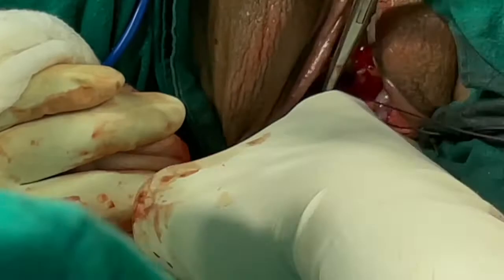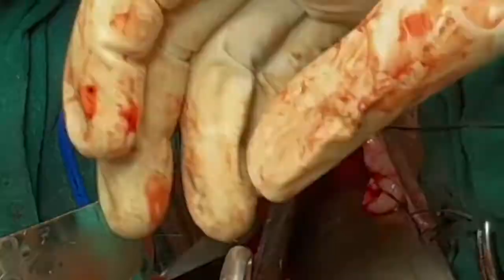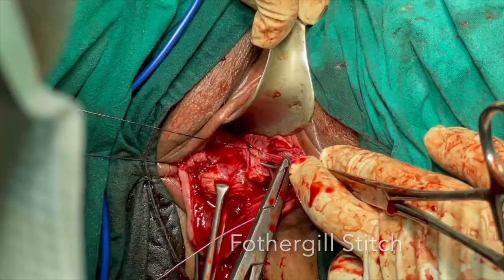In this case, we decided to do sacrospinous fixation of the posterior vagina. Using three Deavers retractors, after approaching the lateral vaginal wall beneath the ligament complexes, we place two stitches to the sacrospinous ligament.